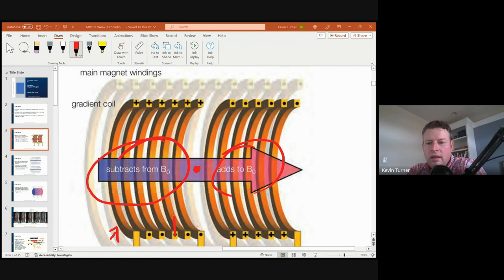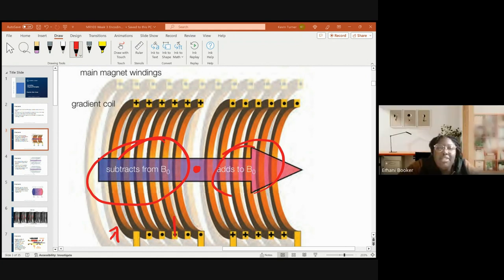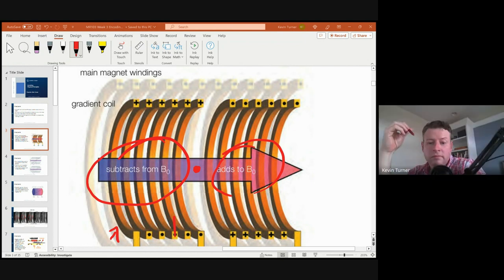Right? So when we turn on, go ahead, Amy. So if it's a 3T magnet, then it's less the further away, like the Tesla would be weaker? Yes. It would get stronger on one side of the magnet and weaker on the other when we turn on the gradient. So it's going to make the magnetic field stronger on one end and lower on another, because it's a new magnetic force we're adding. So as we add more force, the magnetism is going to get stronger and weaker.